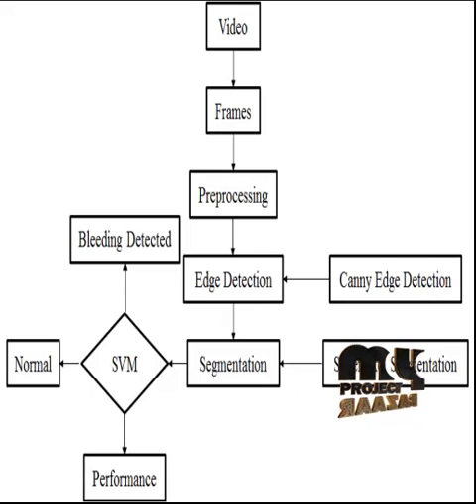Let me see the flow of the process. In this process, the video is taken as the input. The videos are converted into frames. In this frame conversion, different videos have different frame length and frame width, and based on that the conversion is employed. After frame conversion, pre-processing steps are employed.